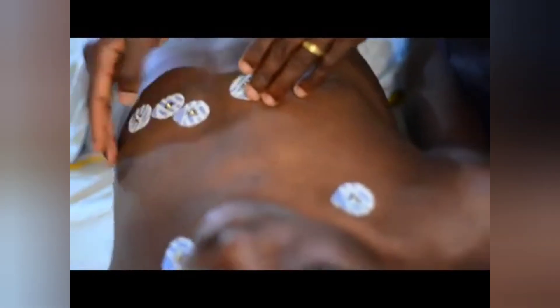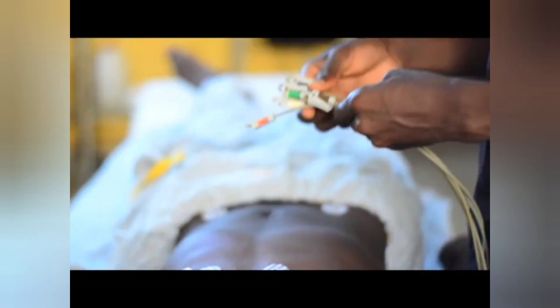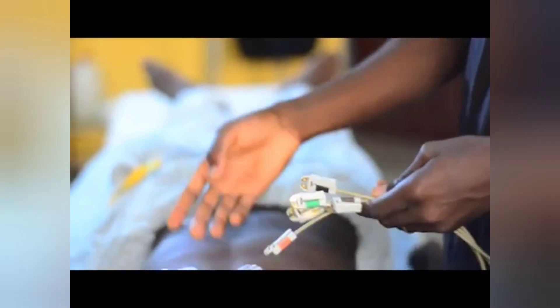So these are the ten electrodes used in a standard 12-lead ECG: right hand, left hand, V1, V2, V3, V4, V5, and V6, plus right leg and left leg. All you need to do now is connect your cable appropriately to the electrodes and you are good to go.